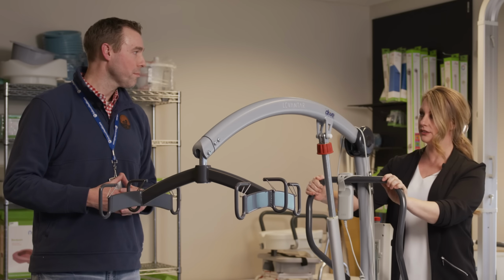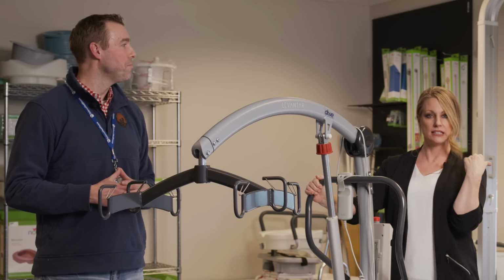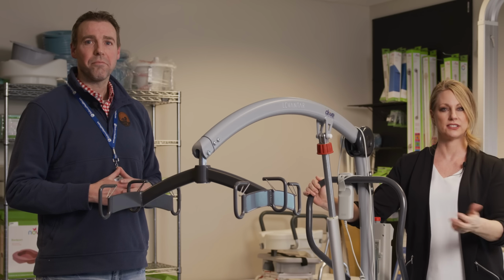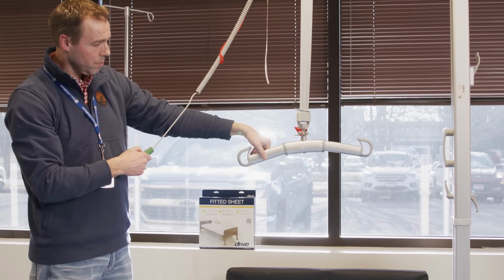There's one you have here that isn't talked about very often, but I hope we can take a look at it. It's a great solution if you have the means to do it. But again, I don't see it very often. So let's come take a look. This is another option for a lift system instead of a ceiling lift.